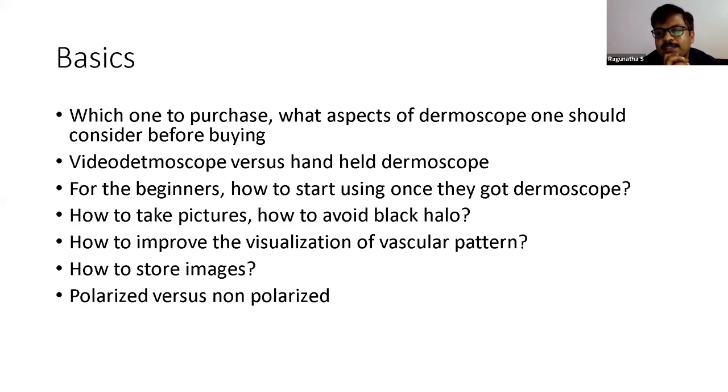I think if keratin is showing parakeratosis, so it is nucleated keratin, then it's a cellular mass, so it will be easily visible as an exfoliating scale on non-polarized, as well as polarized. And if there is a dermal fibrosis or collagen is very well thickened, and your epidermis is not very greatly melanized, you can see it on making the light polarized.